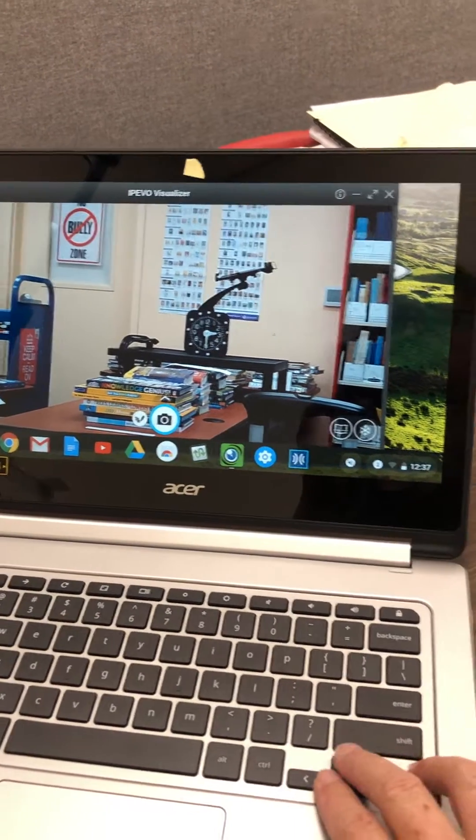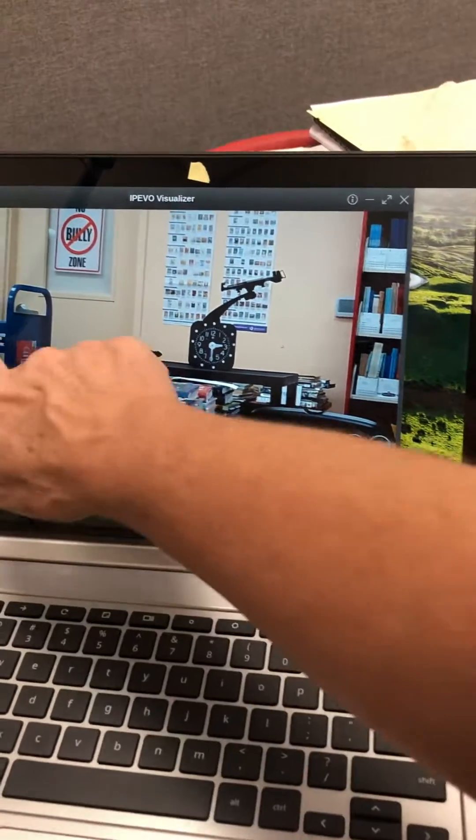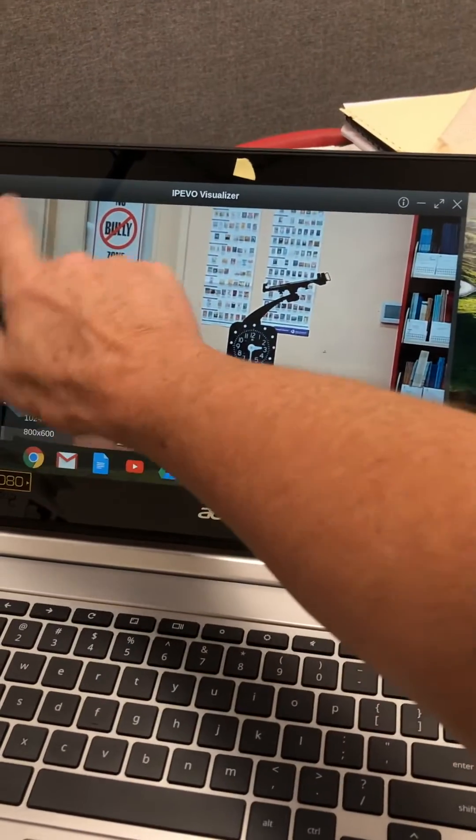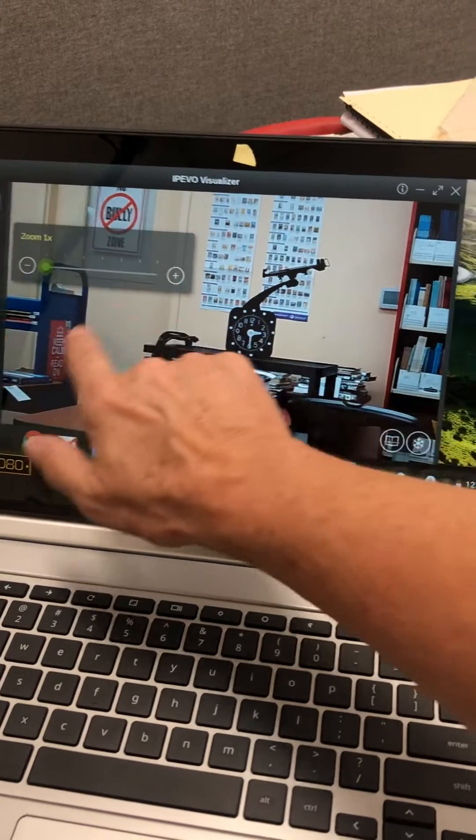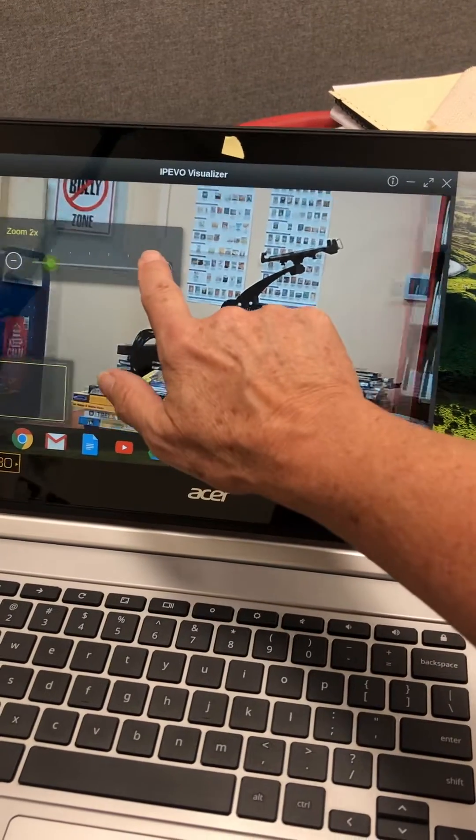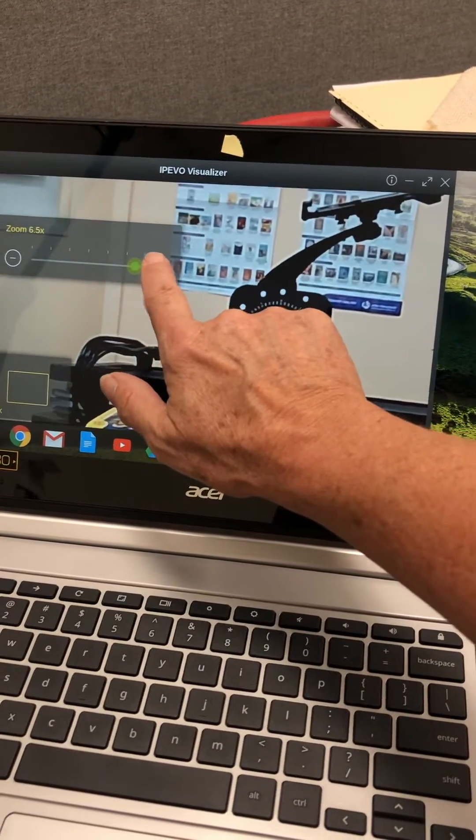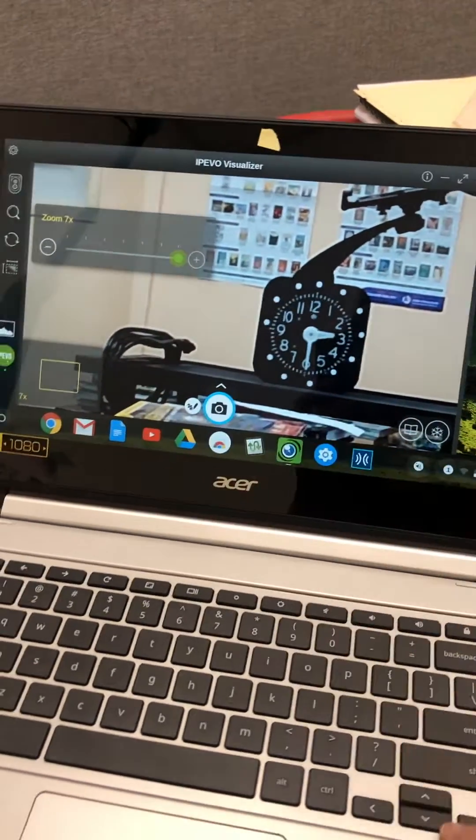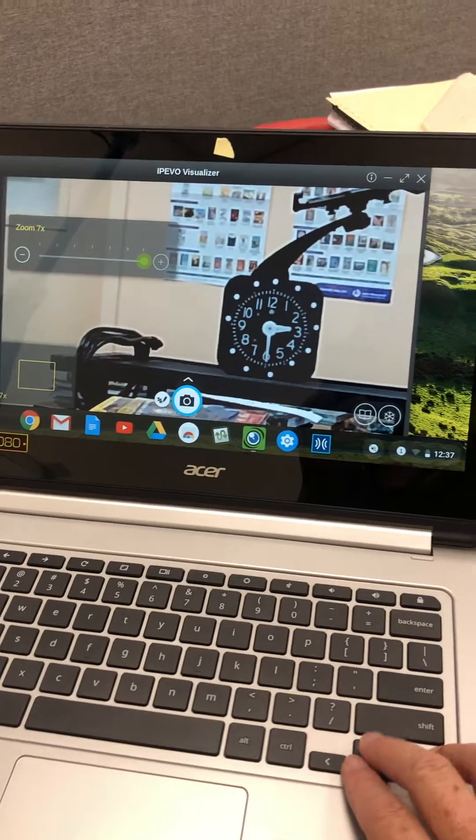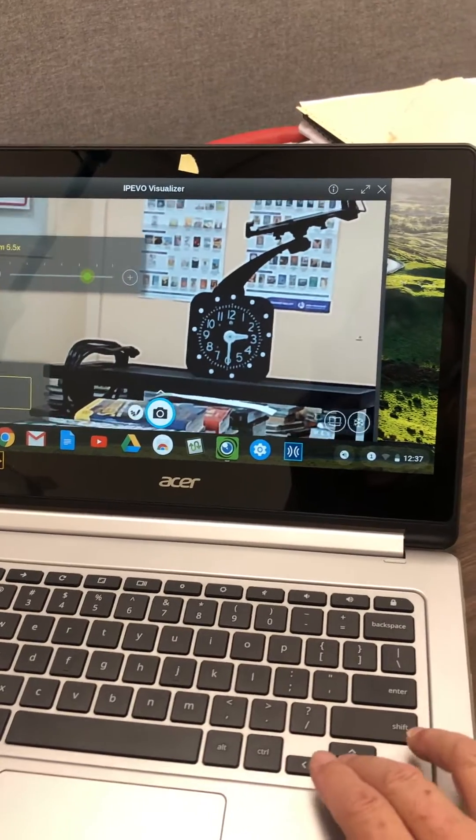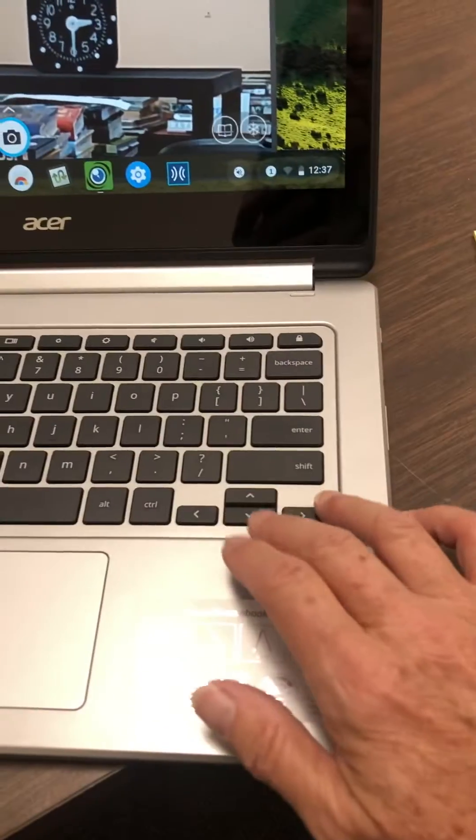So I can zoom in. This is a touch screen Chromebook, so I'm doing it there or I could do it with my arrow keys.